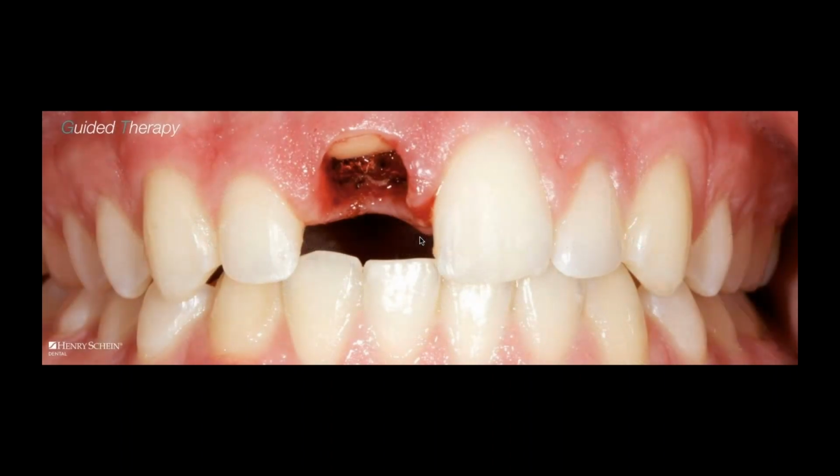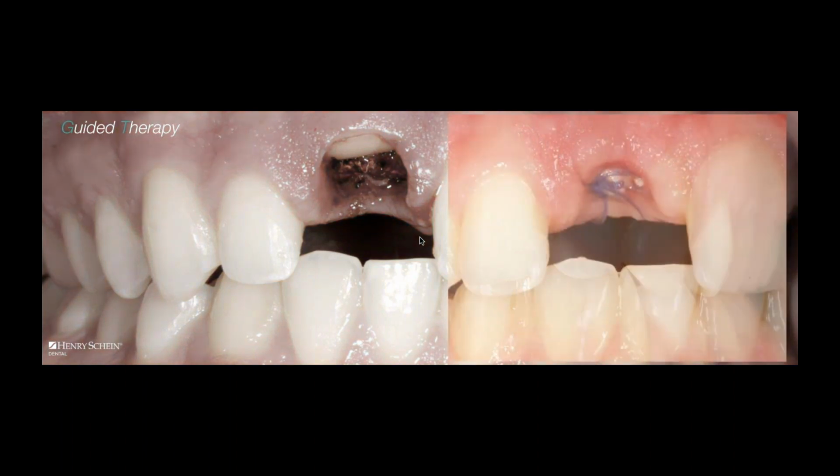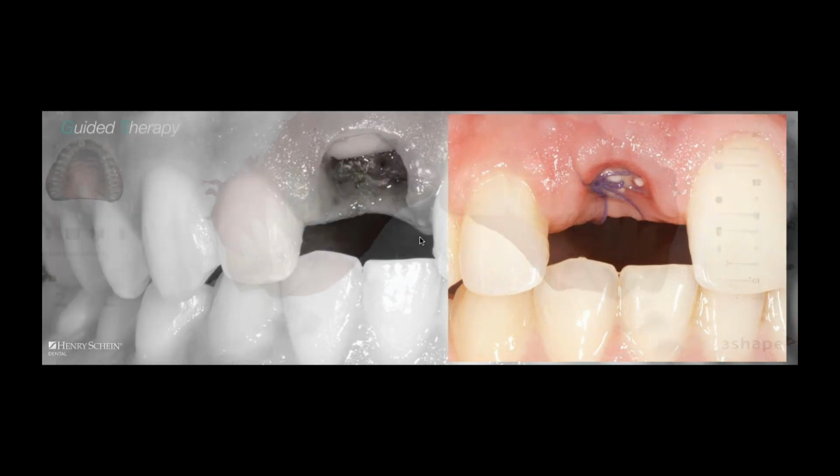Take a case like this, one of the hardest cases you'll ever do in dentistry, which is the replacement of a traumatically injured maxillary single central incisor with a dental implant. This kid was playing basketball. He got elbowed in the face, came to my office a few hours later. We decided to extract and graft just to create the ideal maximum amount of volume of hard and soft tissue for us to utilize. We didn't opt to place an immediate implant because we weren't sure the exact nature of the trauma, if there was more trauma to the dental alveolar complex or not.